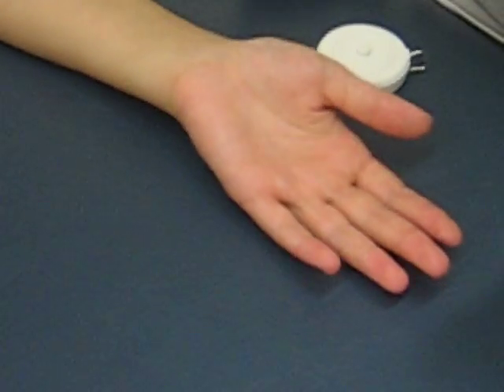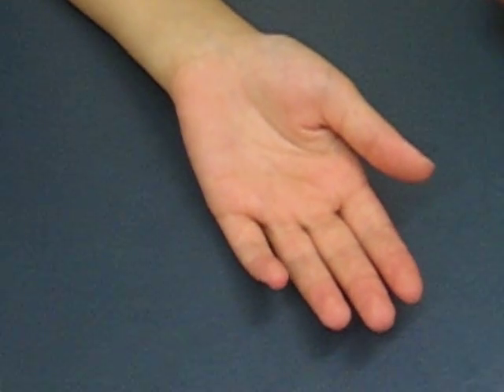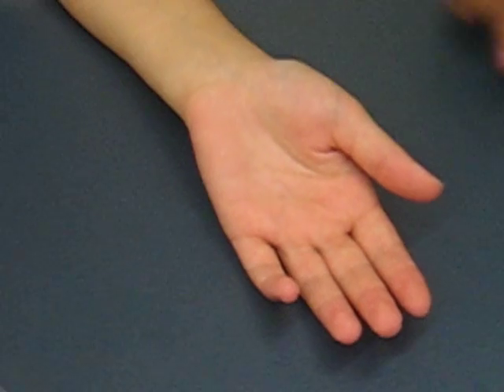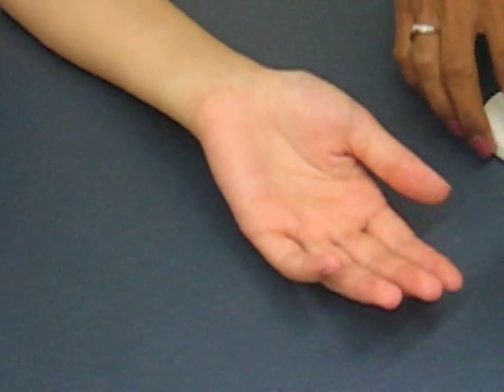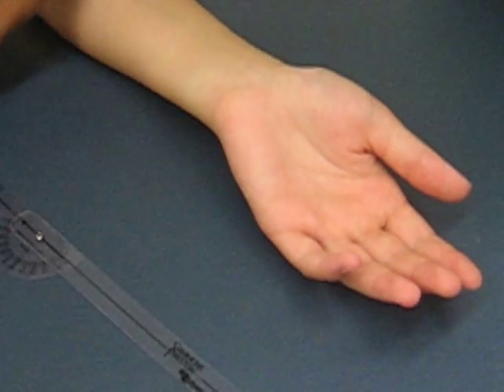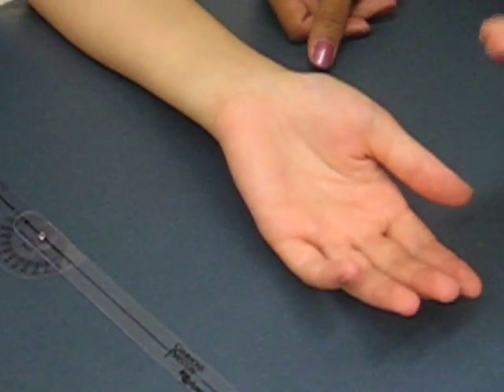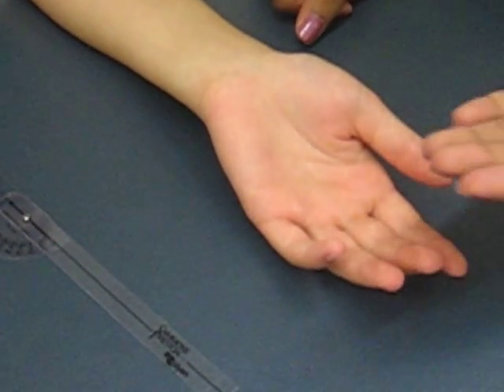Now we're going to move on to thumb metacarpophalangeal flexion. The patient is going to be sitting with their forearm resting on the plinth. We're going to be using a goniometer, but I'm going to have the patient first flex their thumb in this motion.